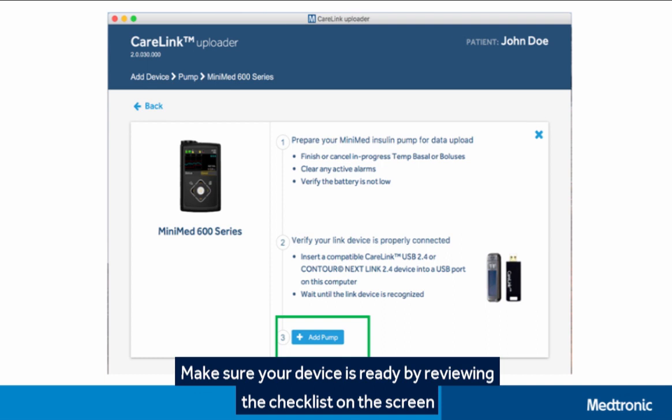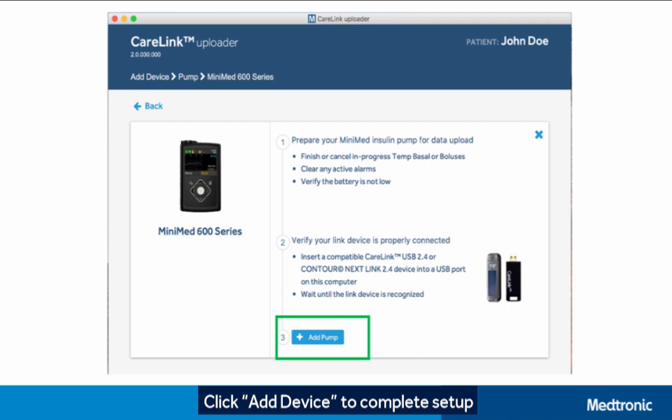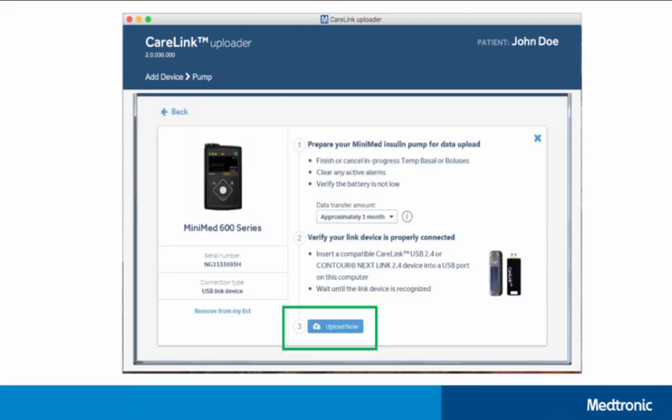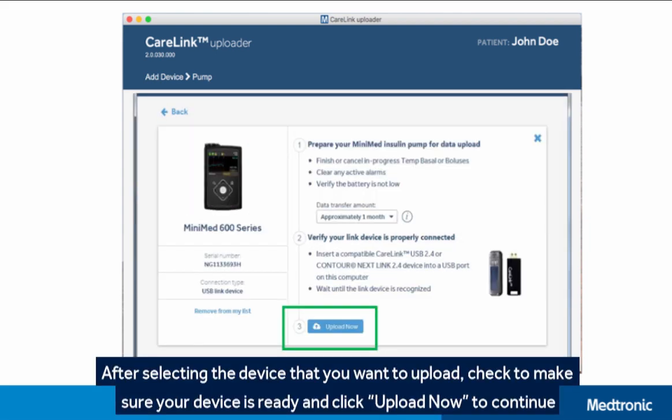Make sure your device is ready by reviewing the checklist on the screen. Click Add Device to complete setup. Once you've added your device, you'll be able to quickly select that device from your list.